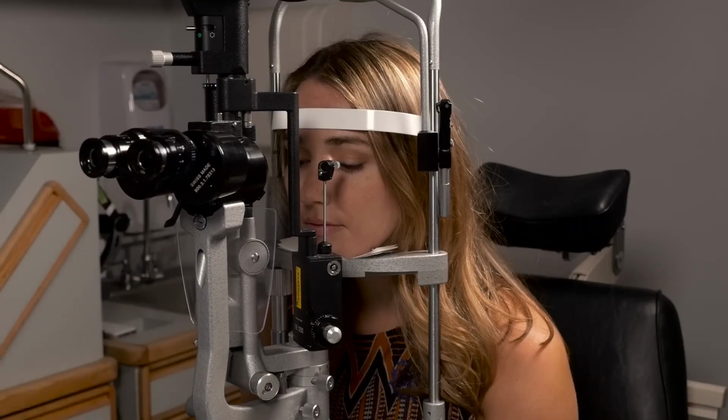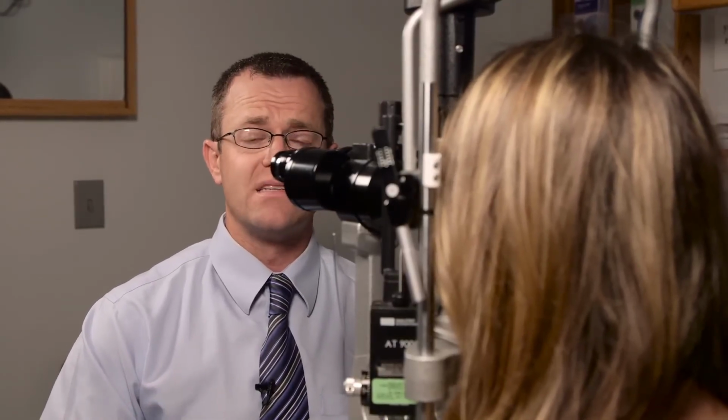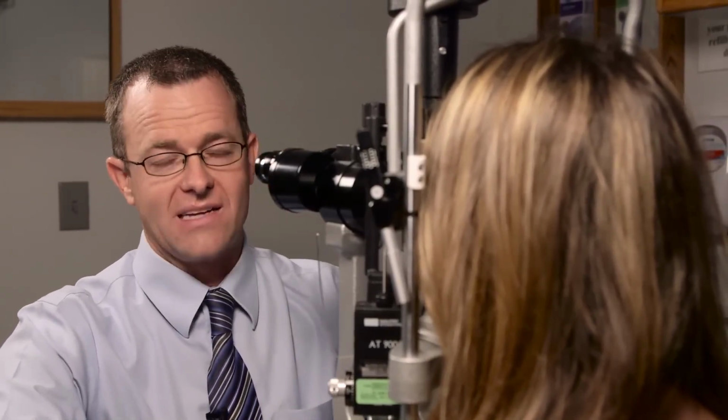So next thing I'll do is there are different settings on the power of the beam itself. I usually set it on the half. There's a half and a 1. You don't need to blast them with light, but at the same time, you brought them here to do an eye exam, so you might as well make sure you have enough light to be able to see. Sometimes patients will be light sensitive. Their pupils are dilated, they may have inflammation or redness, or for whatever reason they may be light sensitive. But I do think it's important to make sure you use enough light so you can see, and then just be patient with the patient to make sure that you don't blast them with light too bad.